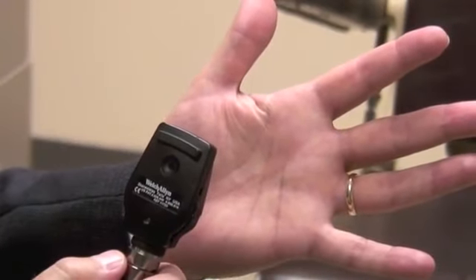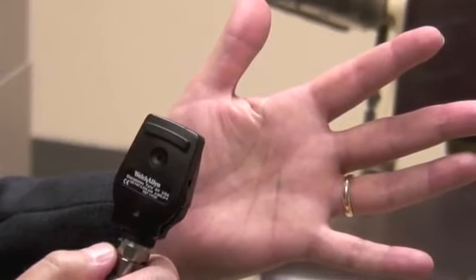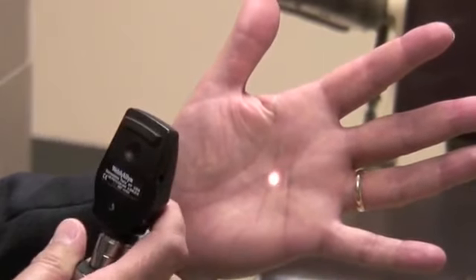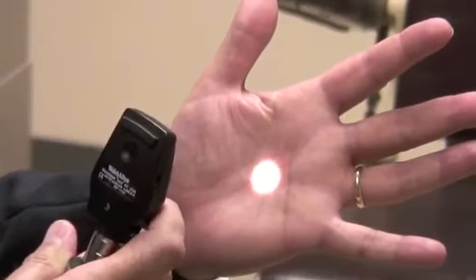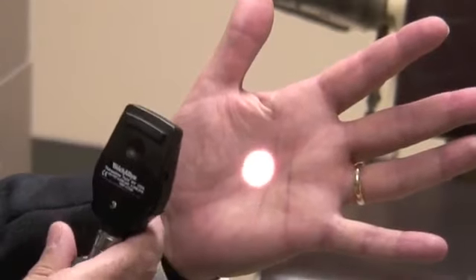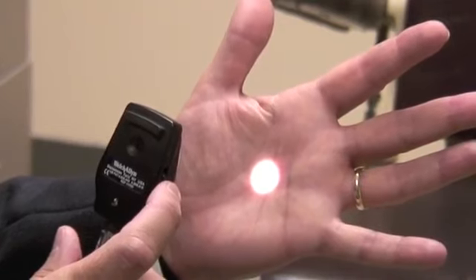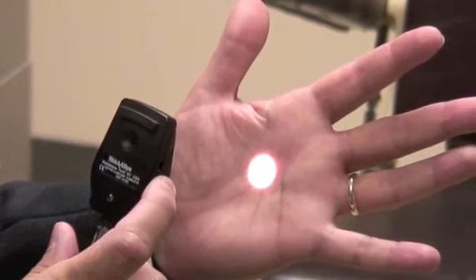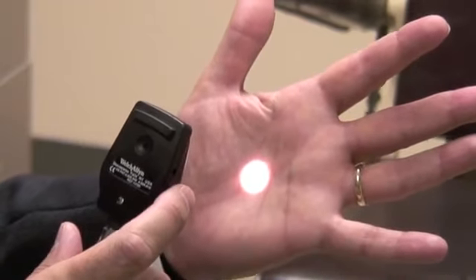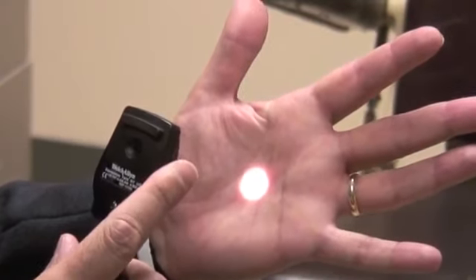To perform the red reflex test, one wants to use the largest circle of white light available through the direct ophthalmoscope. The direct ophthalmoscope comes with several different tools, as seen here. Your goal is to find your largest circle of light, as shown here, and use that light to do the test. You can do this test with your glasses on or off, but the patient's glasses should be off. Look through the aperture of the direct ophthalmoscope, and then, spinning the wheel, bring the patient's face into focus.